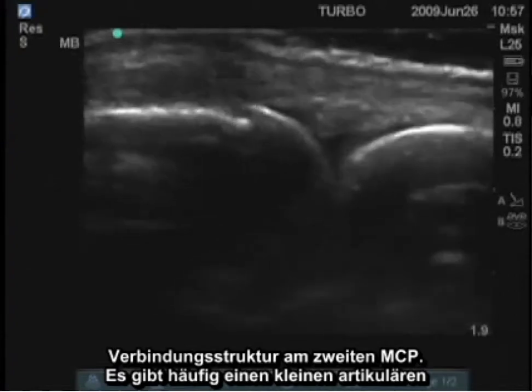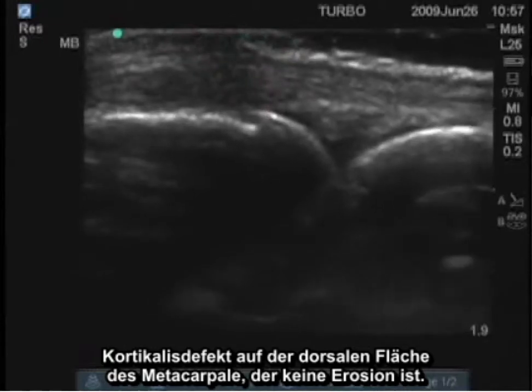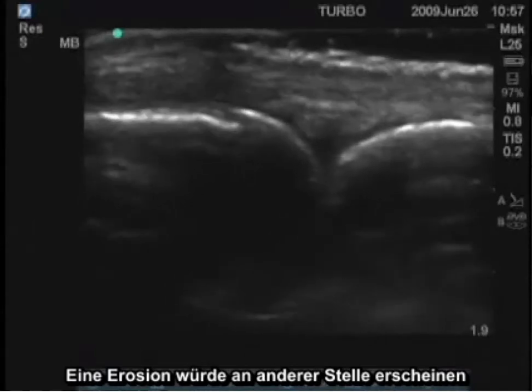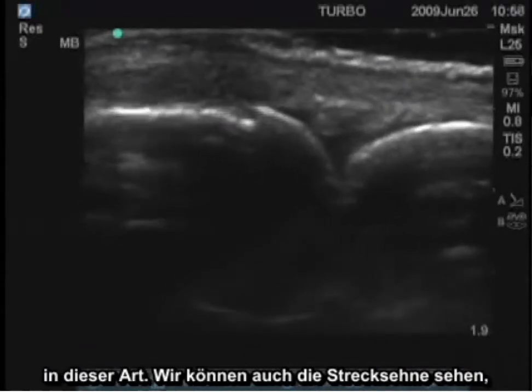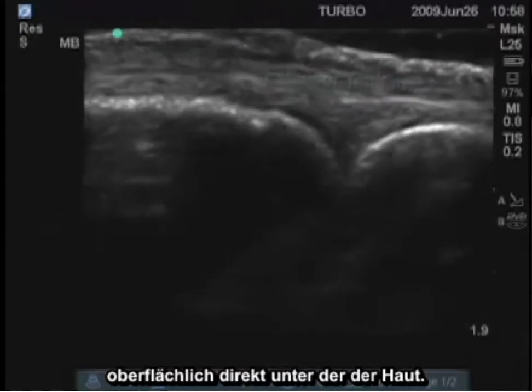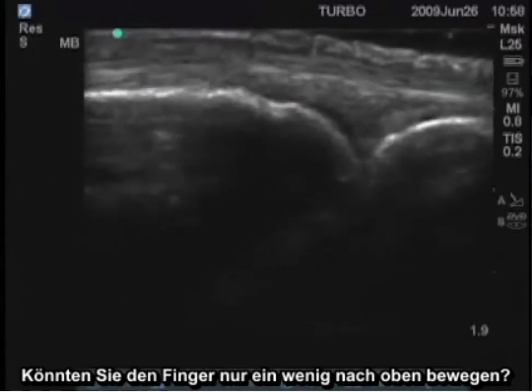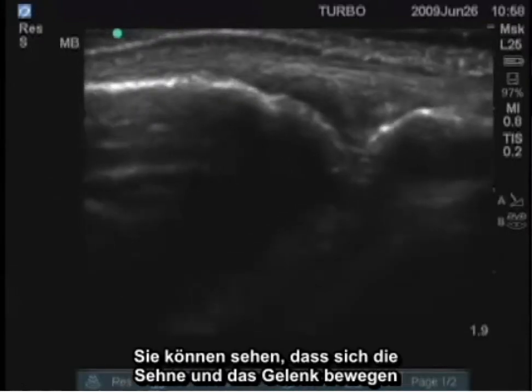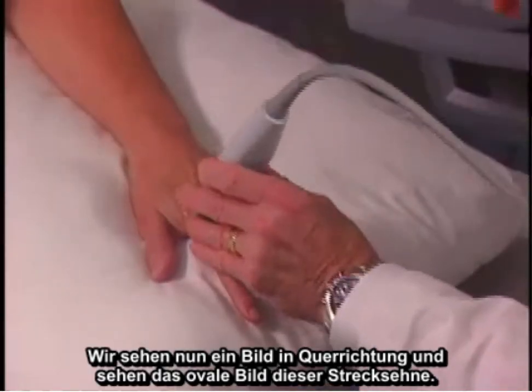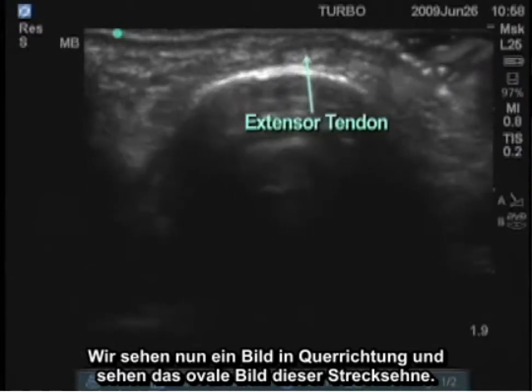There is frequently a small articular cortical defect on the dorsal surface of this metacarpal — that is not an erosion. An erosion would appear elsewhere with this type of appearance. We can also see the extensor tendon superficially right under the surface of the skin. If you move your finger just up a little bit, you can see that tendon moving and the joint moving.